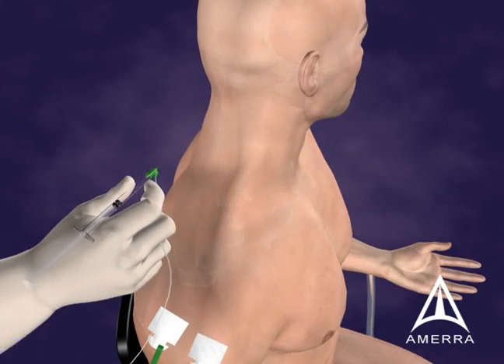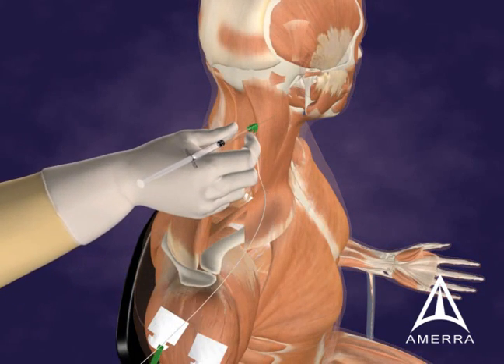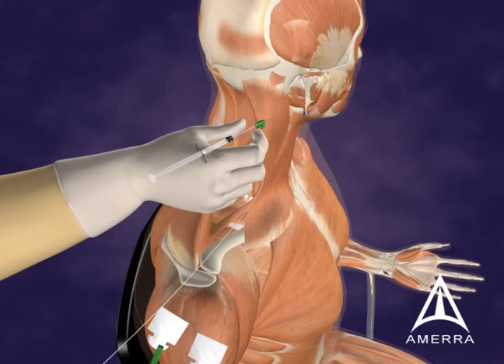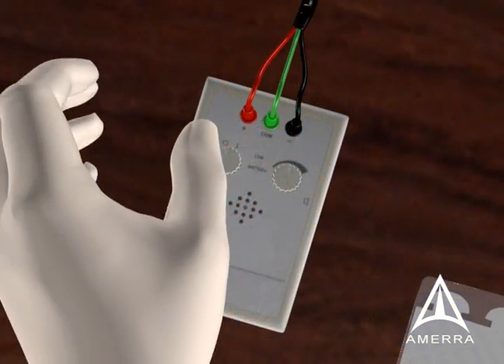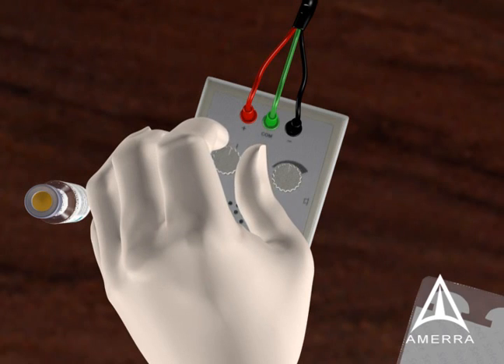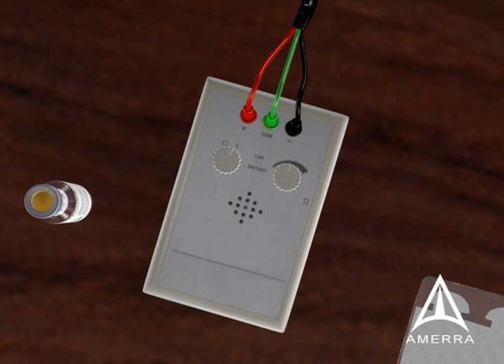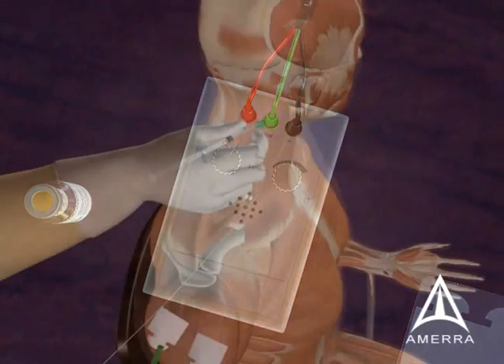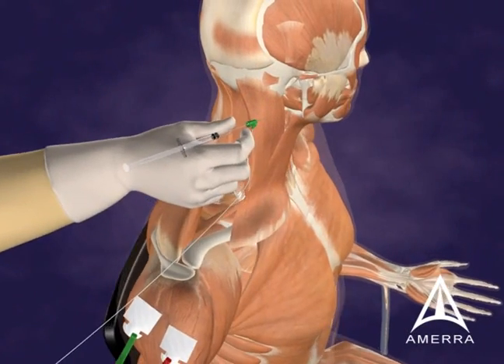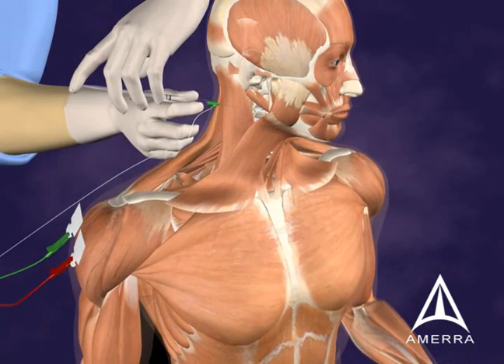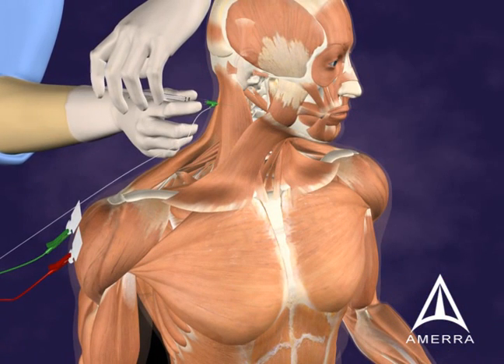In this case, the sternocleidomastoid muscle is injected in the upper third from a posterior direction, and then the EMG amplifier machine is turned on. A sound is generated when the interference pattern occurs from the volitionally activated muscle, or a muscle that is involuntarily activated by the cervical dystonia.